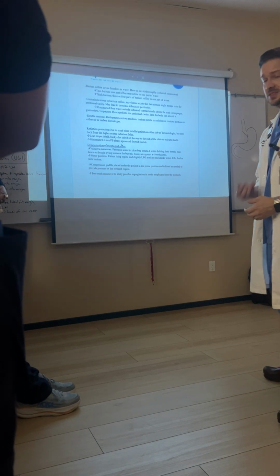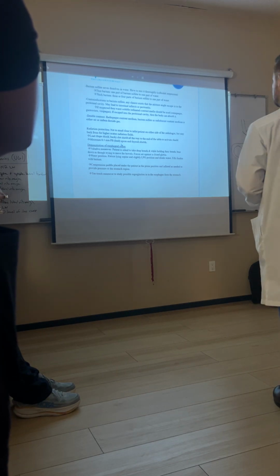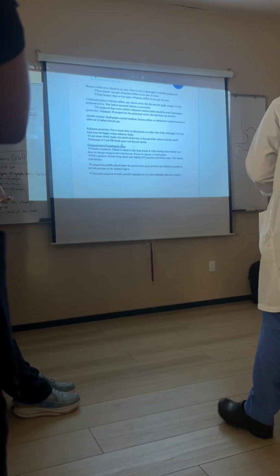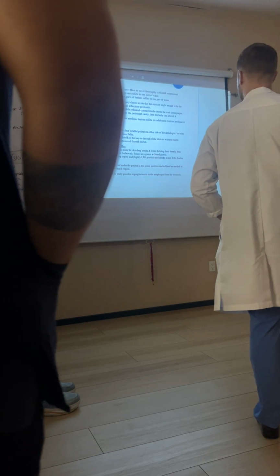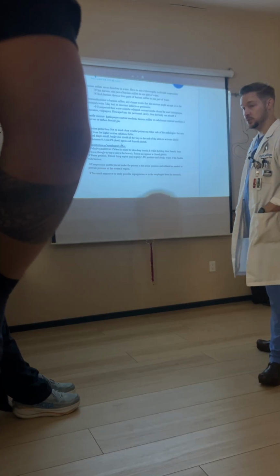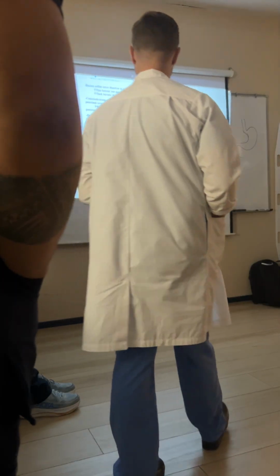The contraindications, again, to barium sulfate are any recent GI surgery or any chance that that mixture of barium might escape into the peritoneal cavity. As we've said before when we talked about contrast a long time ago, it can lead to intestinal infarcts or barium peritonitis, okay? If we suspect that there is some kind of a perforation, we're going to use water-soluble contrast. Again, for the reasons that I said a moment ago, it's going to be absorbed very easily.